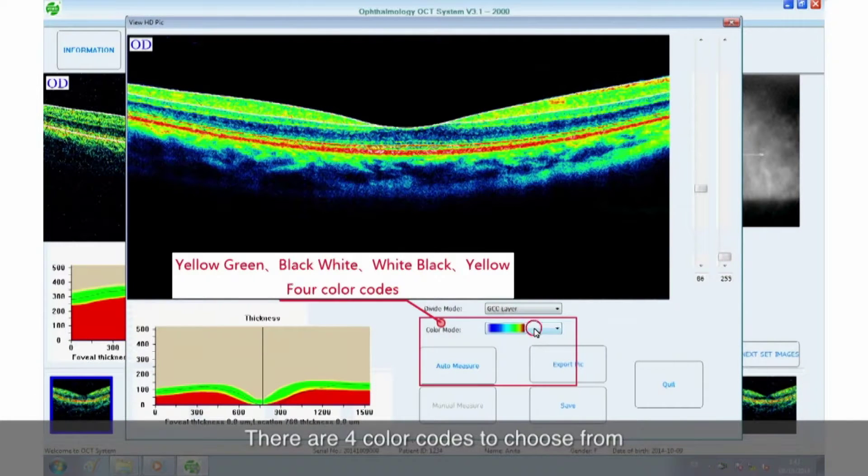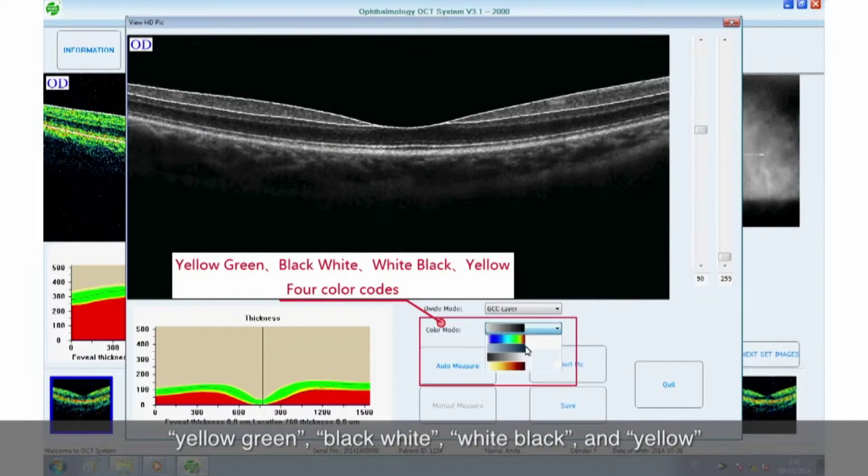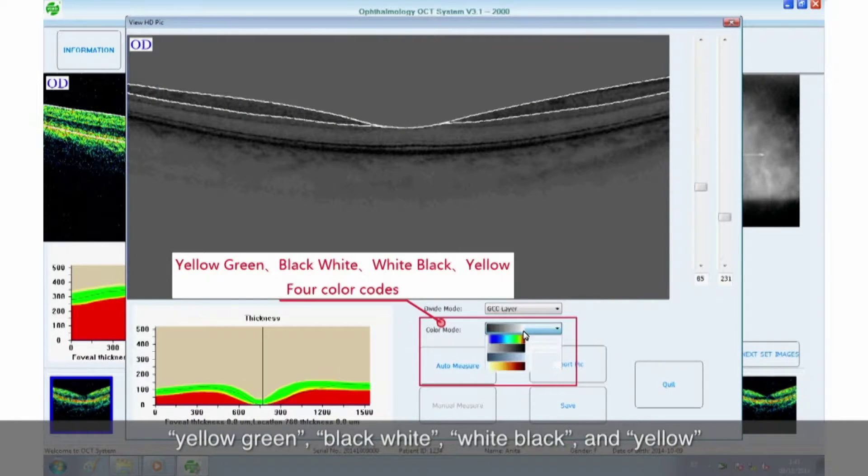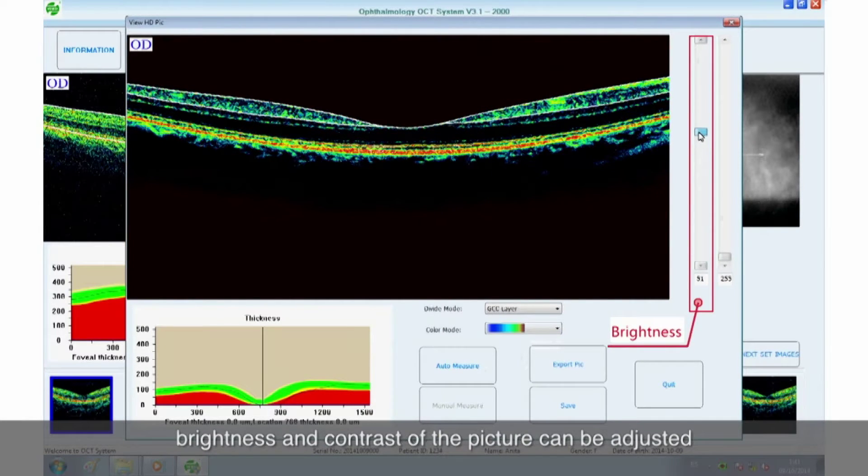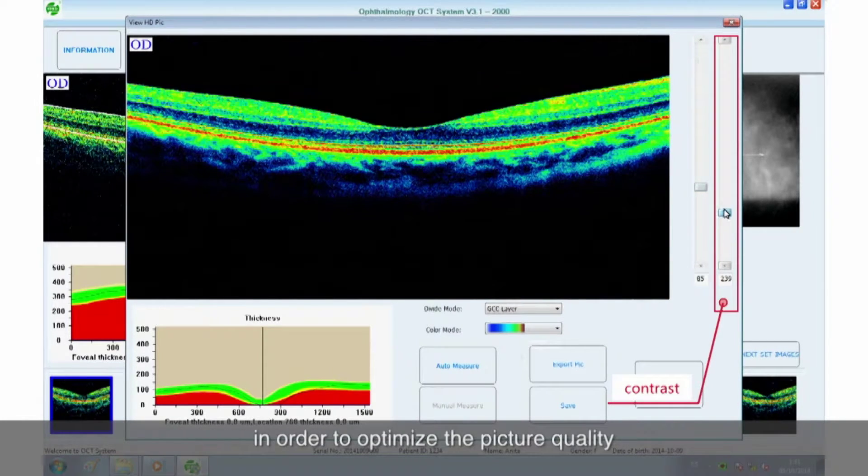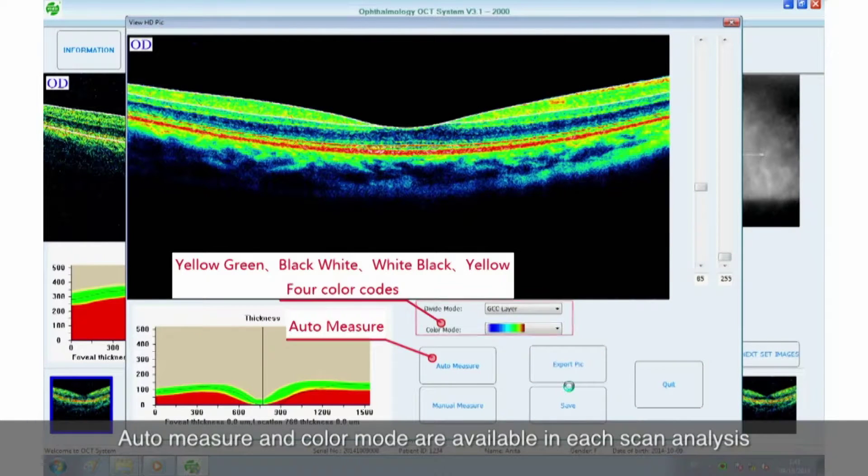There are four color codes to choose from: Yellow-green, black-white, white-black, and yellow. Meanwhile, brightness and contrast of the picture can be adjusted in order to optimize the picture quality. Auto-measure and color mode are available in each scan analysis.